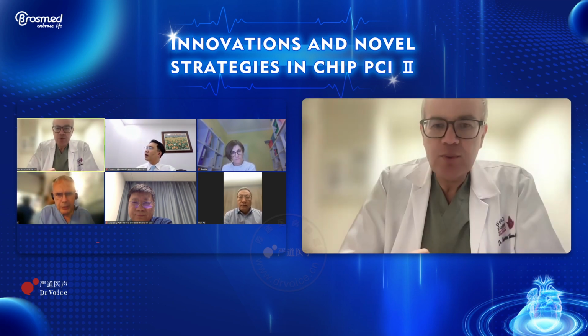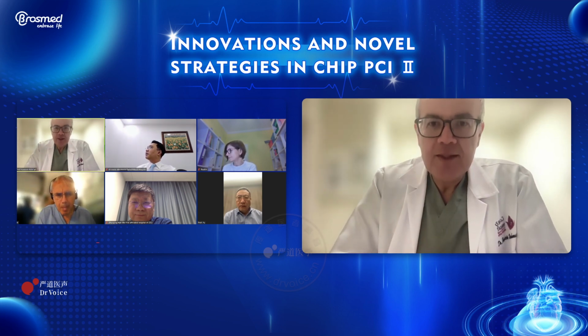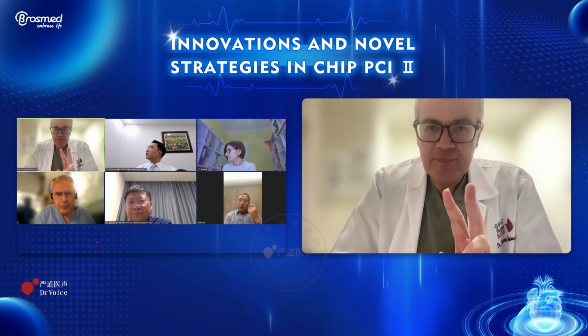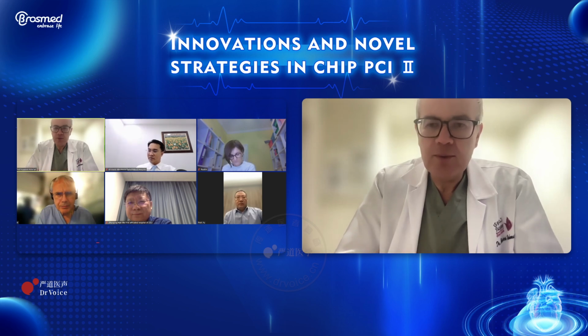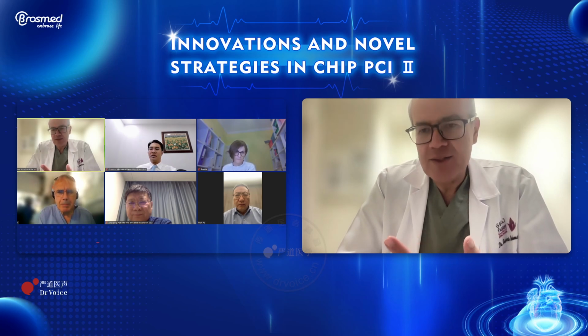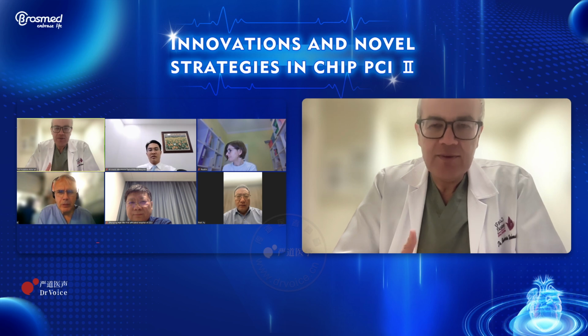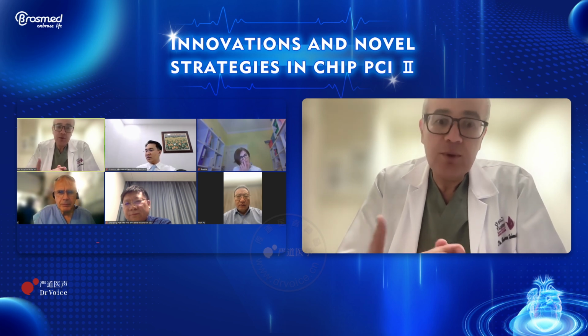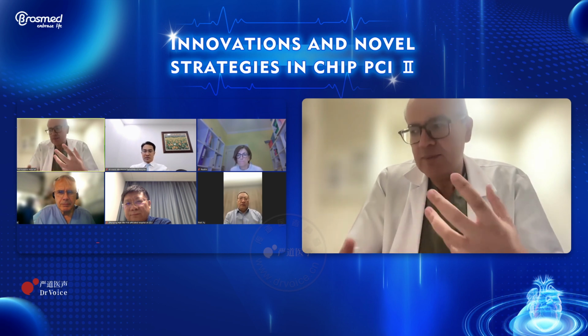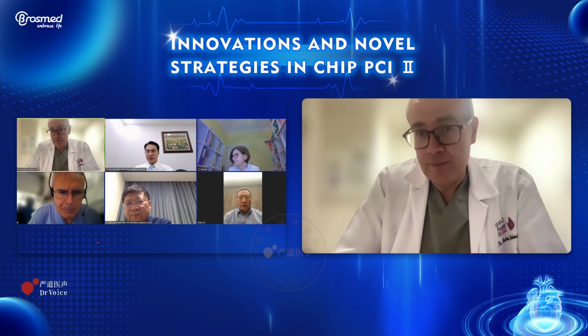I think the main issue with acute coronary syndromes, or a big issue, is the thrombus. So the thrombus poses two problems. The first problem, the more you try to modify the plaque or the atheroma, the more you run into distal embolization, which you want to avoid, of course. So that's the first problem with the thrombus. The second issue with the thrombus is it may hamper the delivery of the drug into the vessel wall. To avoid that, you need to do good modification, but if you insist on multiple attempts of modification, NC, scoring, cutting, etc., then you will embolize more.